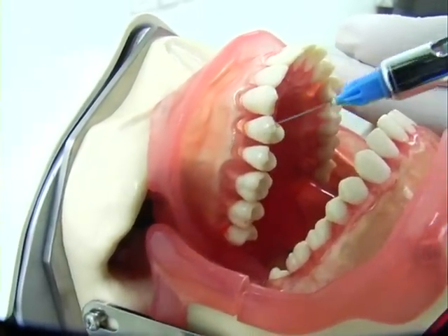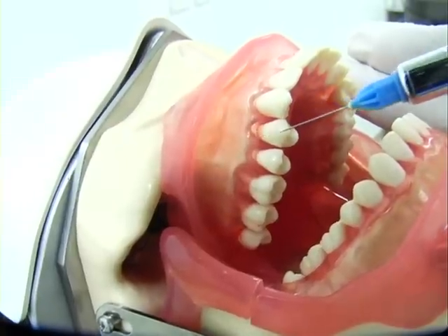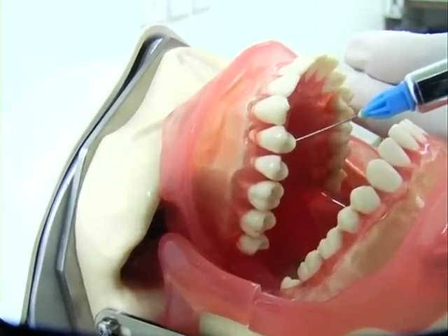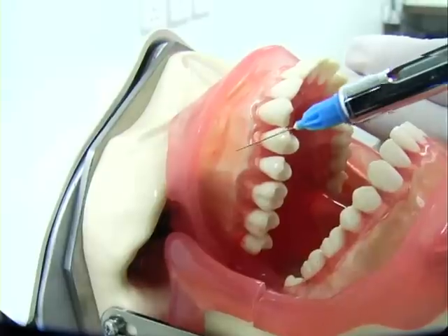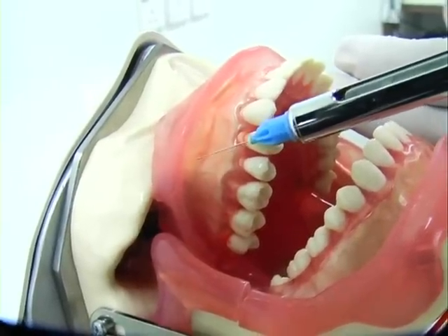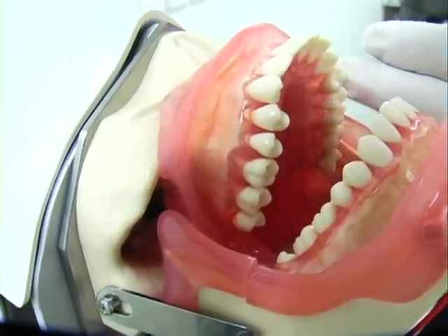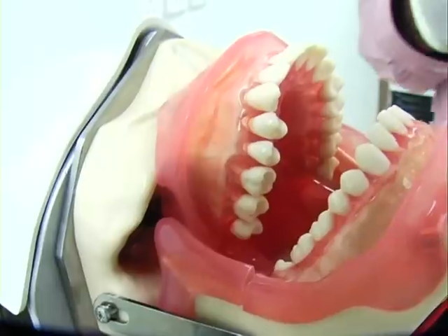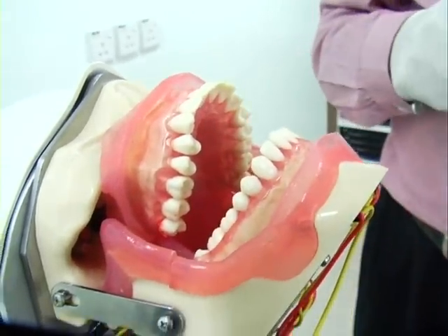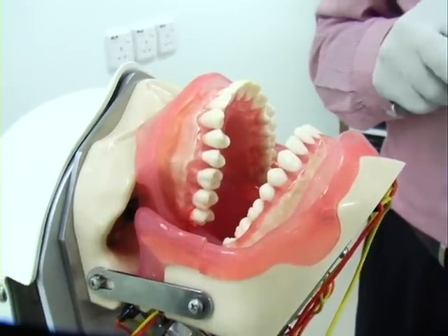Similarly, for the posterior teeth, you have to deposit at the site of the root of the tooth that has to be anesthetized. For example, if you want to anesthetize tooth one-four, you have to go and deposit the solution around that area. That's the end of the infiltration in the maxilla. Thank you very much.